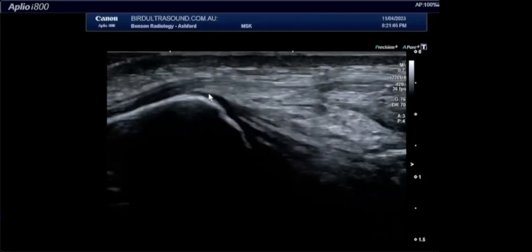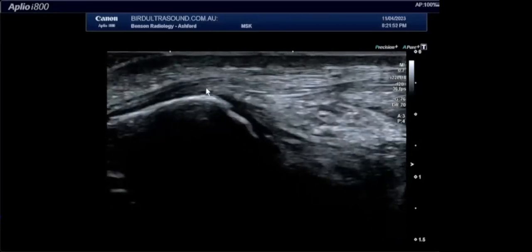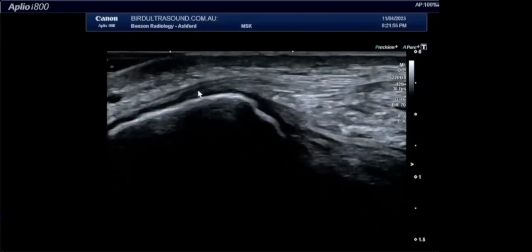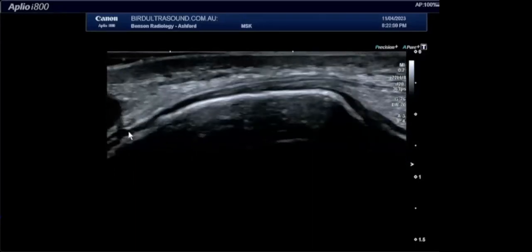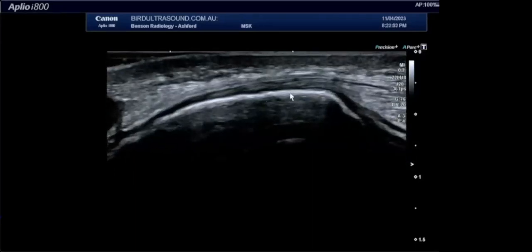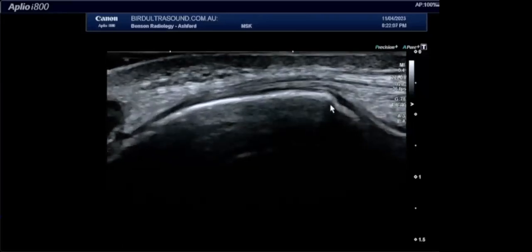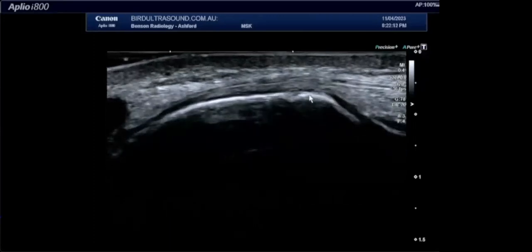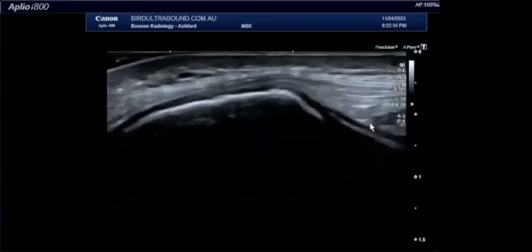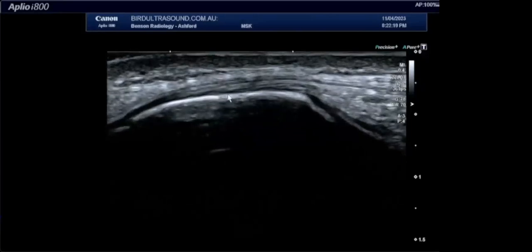I'm not sure what to call this structure. We came up with a cute little name, the liganaculum, because it's a ligament and a retinaculum that are joining together and making a single structure. And then you can see the way that this structure attaches onto the medial malleolus here. And you can see how deep and broad it is. It comes all the way across right over to here. This beautiful collagen here can be stripped away from that medial malleolus. And this is a type of degloving injury that's not uncommon with inversion injuries to the ankle, and it's very, very painful. When you deglove the medial joint capsule and the flexor retinaculum from this medial malleolus here, it usually takes a bit of periosteum with it.